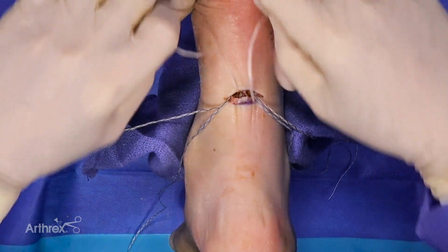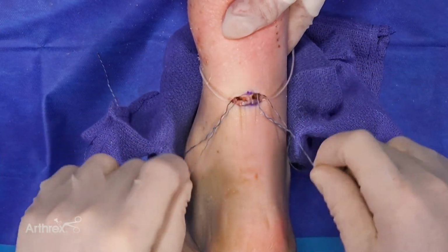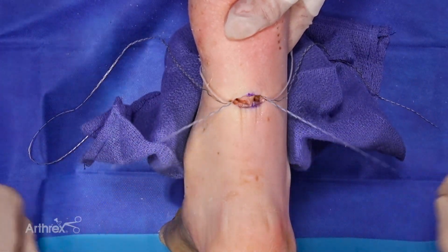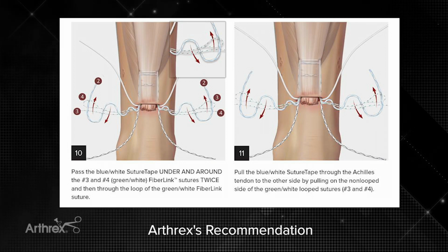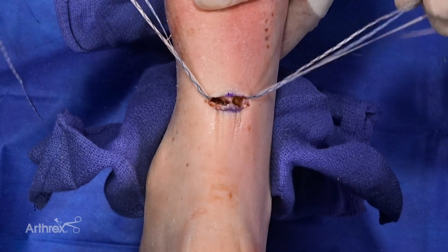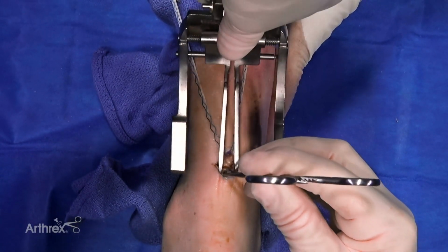And then I test them all. So here's my most proximal one, I test it. My most distal one, test it. And here's my lock-in suture, I'm testing it. In this situation though, we've got excellent capture of this side. I'll take these sutures, I'll put them up on one end. Now we just do exactly the same thing on the other side.